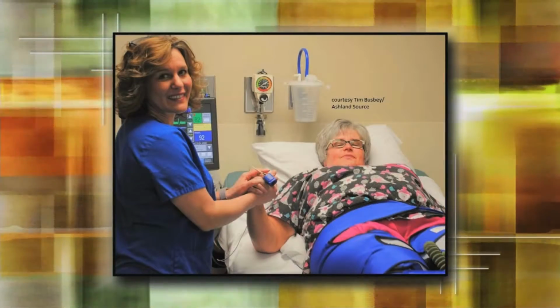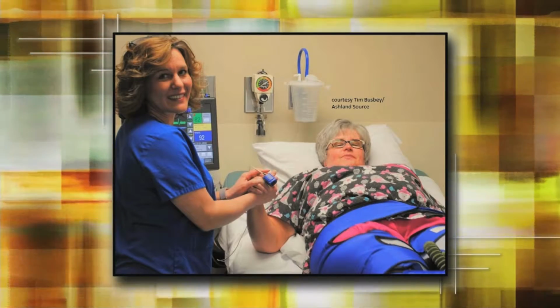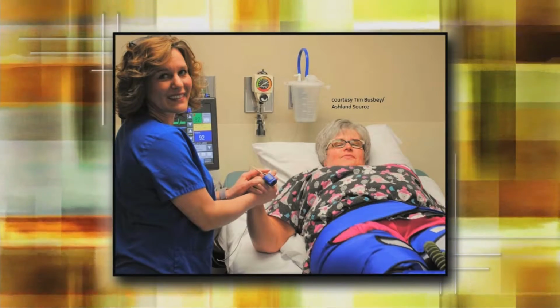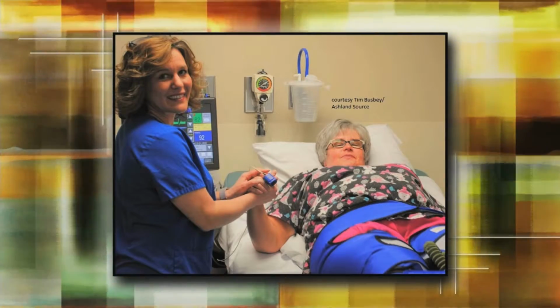Okay, so tell us how EECP works. Well, the patients come in and they run a treatment, and there are blood pressure cuffs on their calves, their thighs, and across their buttocks. It looks much like a blood pressure cuff. And they pump sequentially, milking blood up to the heart to increase the blood flow, circulation to the heart, so the next time it beats, it supplies blood to the entire body. So it's timed with the beating of the heart, right? It is. They're hooked up to an EKG monitor, and so it runs off the timing of that. The nurse runs the treatment and syncs it to time just right.